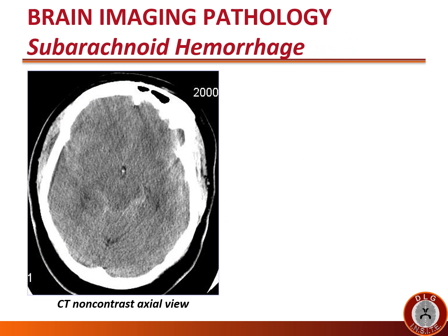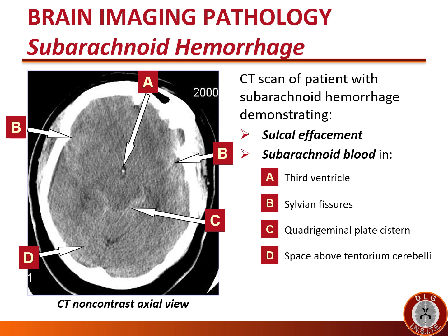This non-contrast CT from a different patient with subarachnoid hemorrhage shows blood in the third ventricle (labeled A), in the sylvian fissures (labeled B), in the quadrigeminal plate cistern dorsal to the midbrain (labeled C), and in the space above the tentorium cerebelli (labeled D). In addition, there is sulcal effacement — the sulci are not seen at all in this image due to increased intracranial pressure that occurred as a result of the subarachnoid hemorrhage.